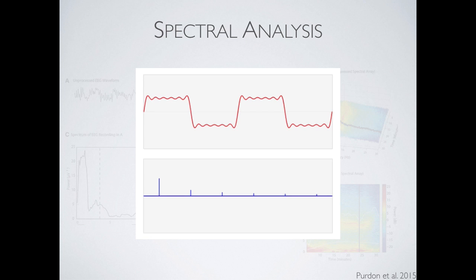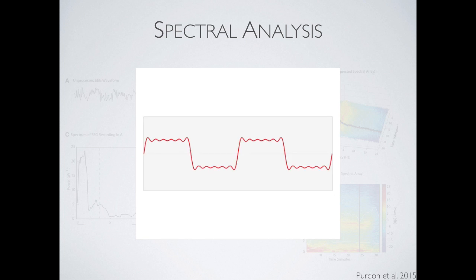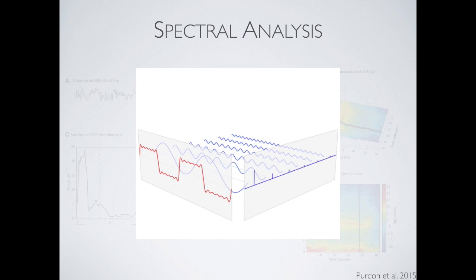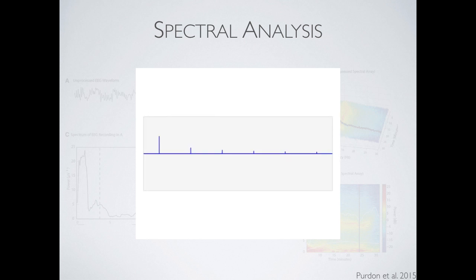So each one of these, again, is representing an oscillation with a different size and a different speed, fast or slow. So if you're measuring the max amplitude of that sine wave, that's conceptually, yes. Just because you can see it, the amplitude of that low frequency one is much, much higher than the fast frequency ones, and that's why you get the largest line to the left.